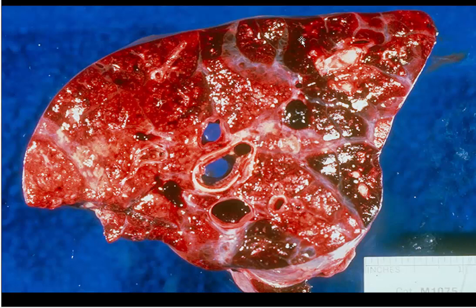Large areas, what used to be called red hepatization, but it's consolidated, very inflamed areas of lung with extensive fibrin and hemorrhage. You can see in here we have distension of the interlobular septa, probably with a lot of edema fluid and fibrin. And when I see these big, angry, hemorrhagic areas in pig lungs, I'm going to go with Actinobacillus pleuropneumoniae.